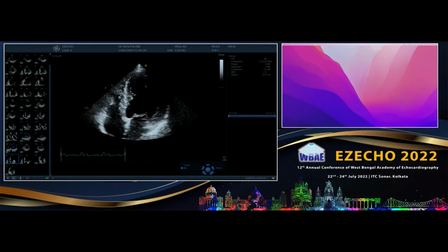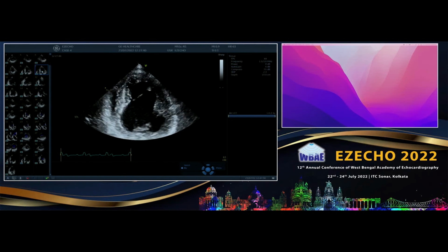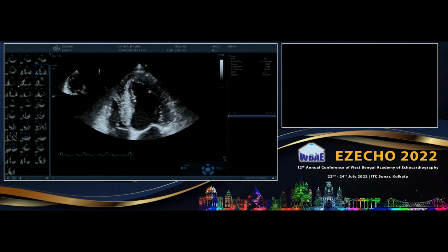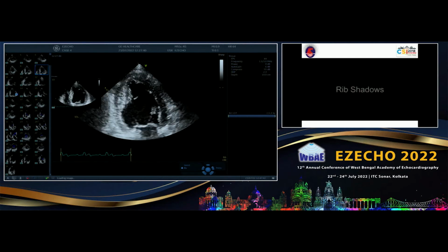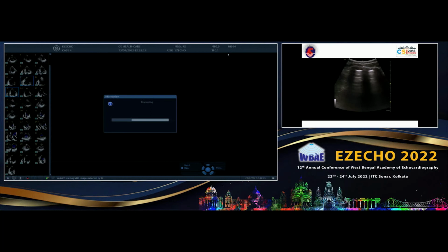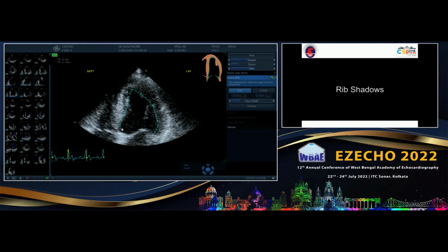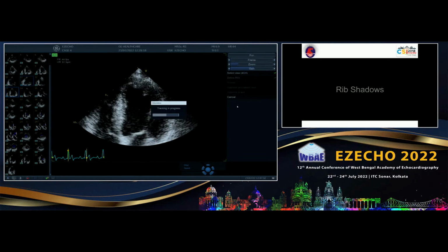Yeah. Now, you were talking about the lung ultrasound. That time we could not show them the actual A line and the B line. Now you can show them. So you can demonstrate them. Yeah, that's the pleural line. Now you can demonstrate that.